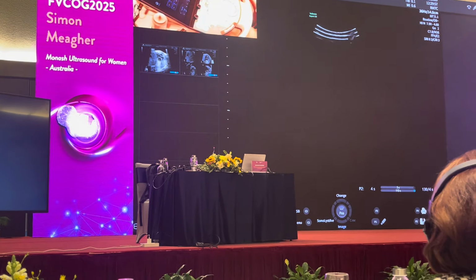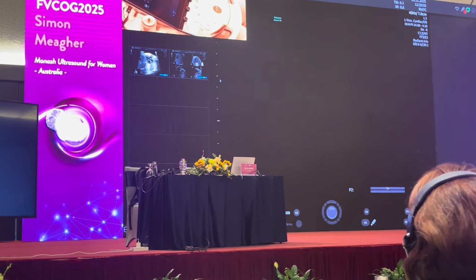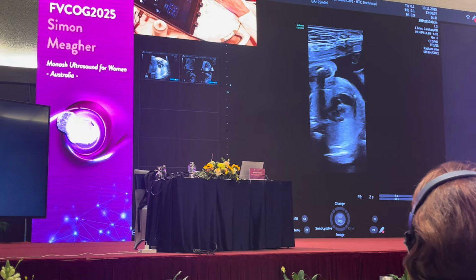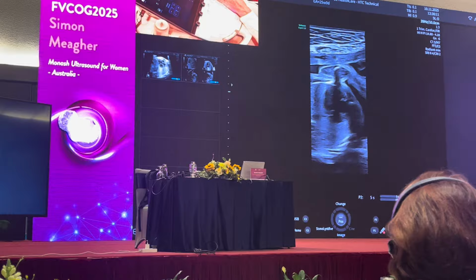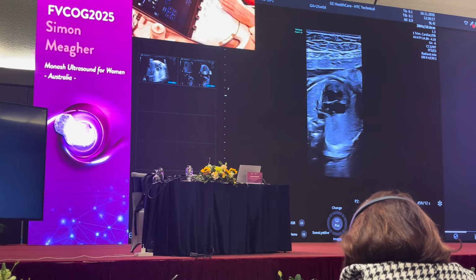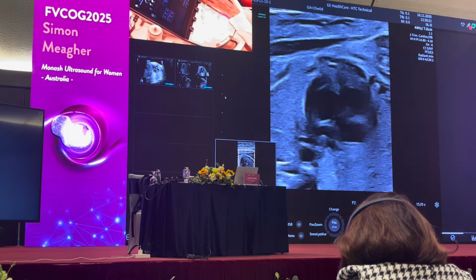This is also just to explain one other thing to try on the baby, the linear 9. I don't think the linear 9 is going to work, but I just want to give it one go. The advantage of the linear 9 is that it can give you some extra detail. Also, one other thing I want to do is examine the baby with the apex of the heart at 6 o'clock to see whether this is complete or partial.